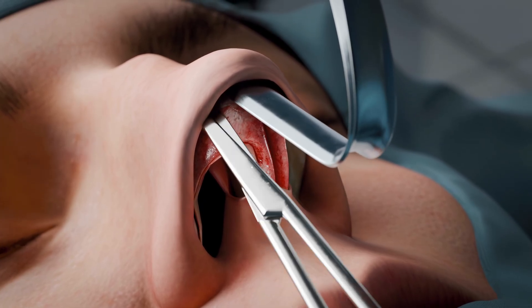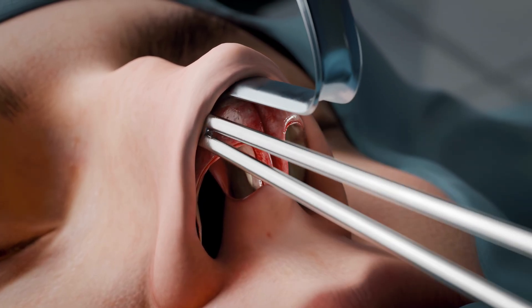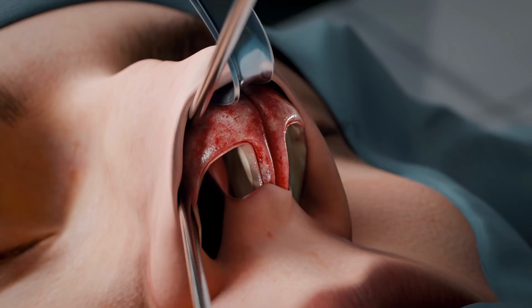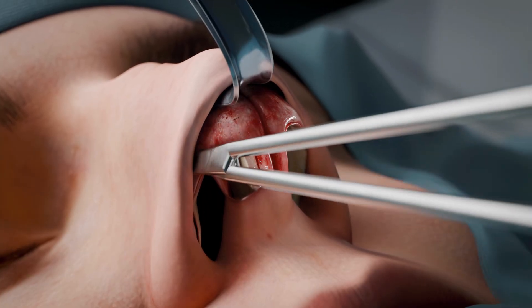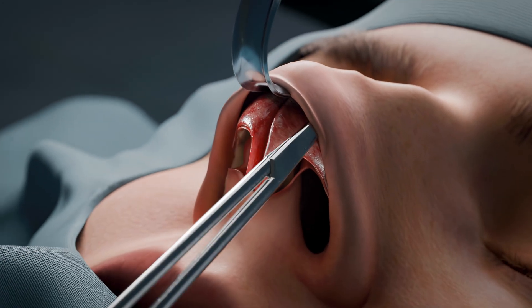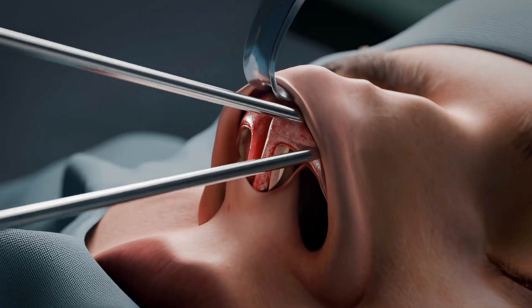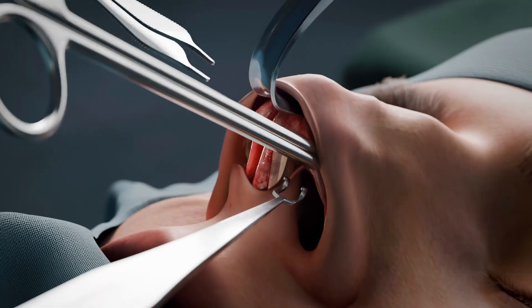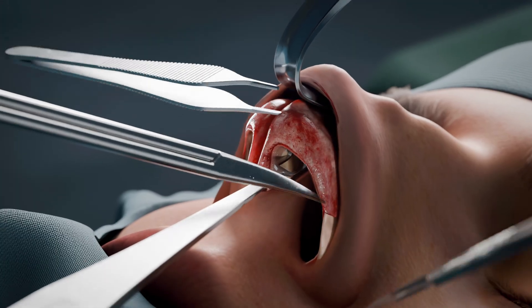Skeletonization follows. Soft tissues are carefully dissected from the lower lateral cartilages, the nasal septum, and the osseous framework, ensuring optimal visualization of anatomical structures.